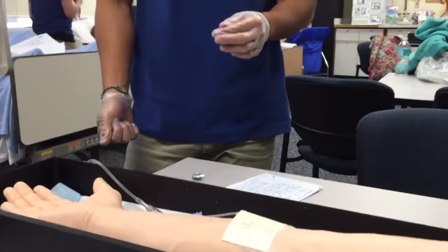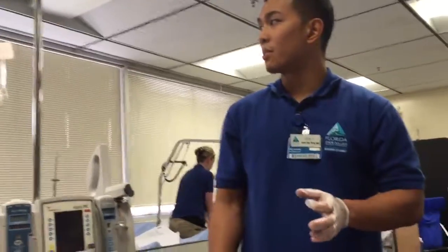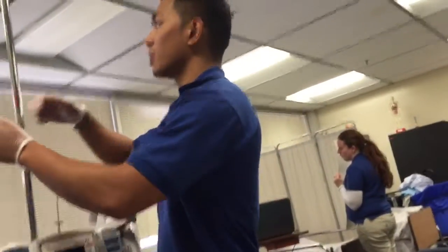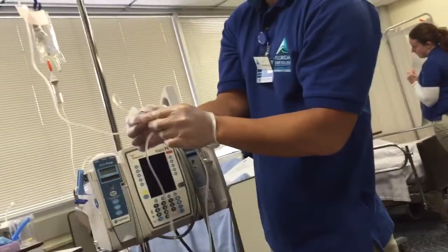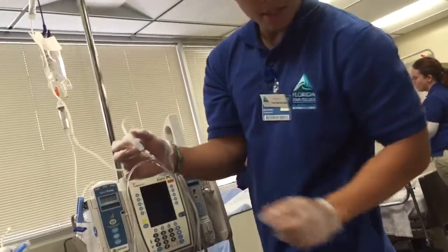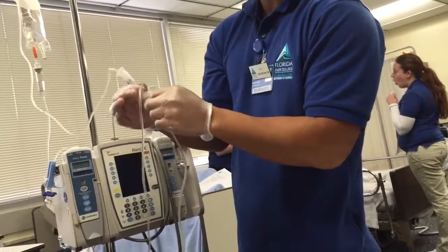So now I'm going to assume that time has passed and the medication has stopped running, so I'm going to go back into the patient's room. Then I'm going to check the piggyback, which it is done running. So I'm going to go ahead and clamp that off. Looks good. I'm going to clamp that, take it off. I'm going to go ahead and grab alcohol again. I'm going to unhook this.